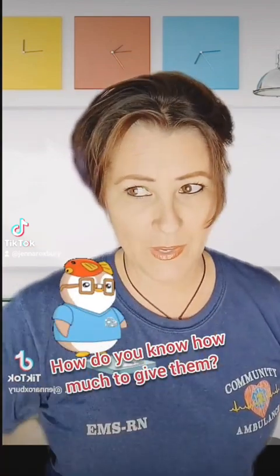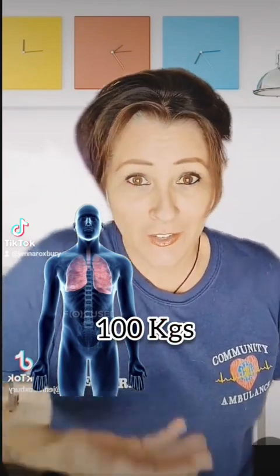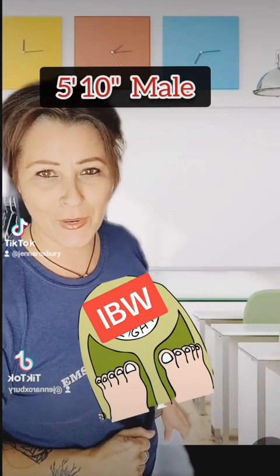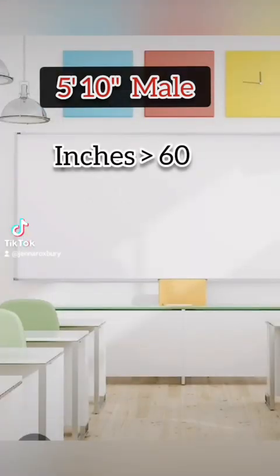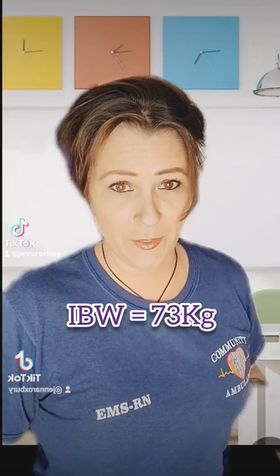How do we know how much to give them? Well, we can't use their kilograms, because no matter what your weight is, your lungs are unaffected by weight. You could be 50 kilograms or 100 kilograms. Your lungs are still going to be the same size. So we have to base the calculation off of their height. So here's the handy dandy little formula that we use to determine ideal body weight. For a 5'10", inches over 60 times 2.3, plus 45 for female and 50 for male, equals your ideal body weight. 73 kilograms ideal body weight.